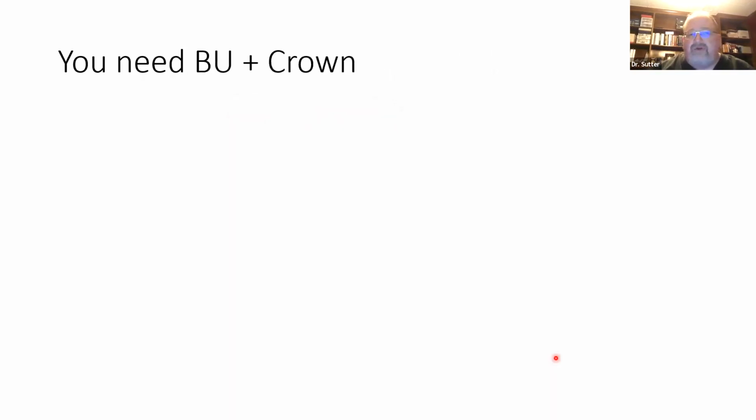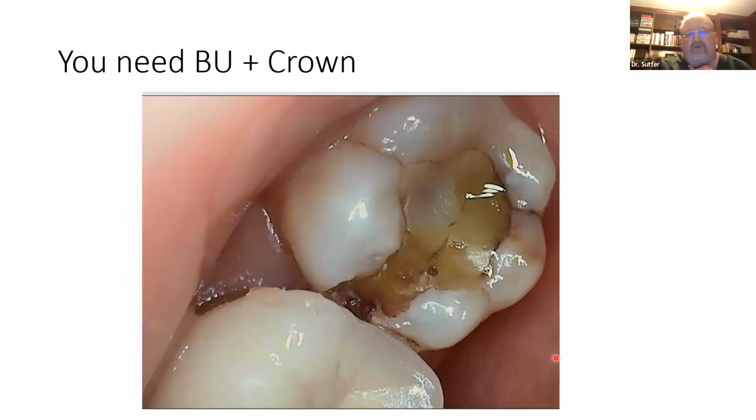Same thing with your intraoral camera. When you see an old filling and part of the tooth broke off here, and they've got fractures like this, that is a crown. We've got a leaky, large occlusal composite that just looks like it's got 100,000 miles on it. It's a crown. It is what it is. The patient sees this and they're just like, dude, can you take care of that? That looks horrible.